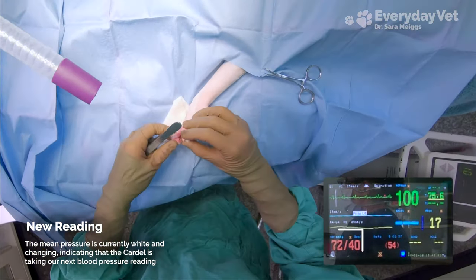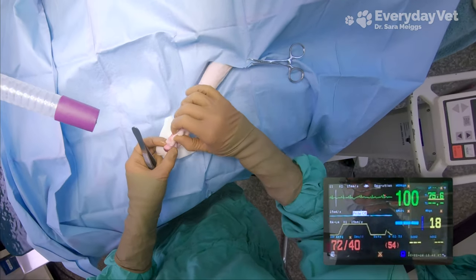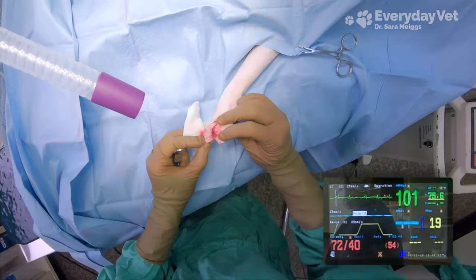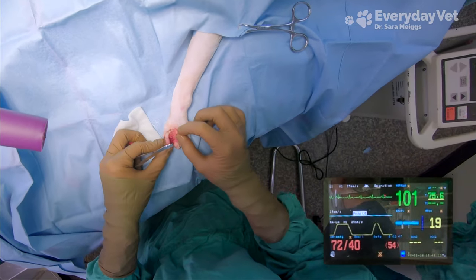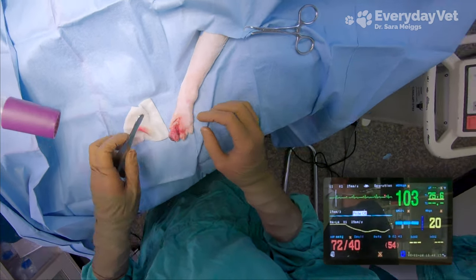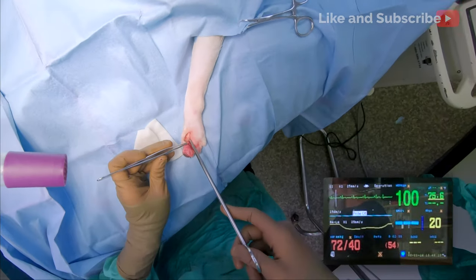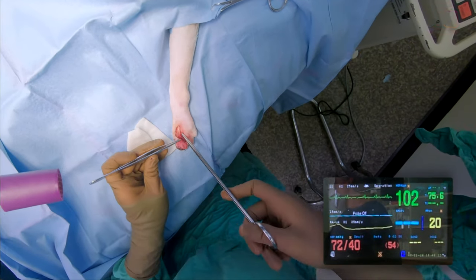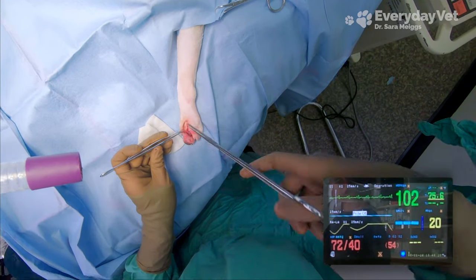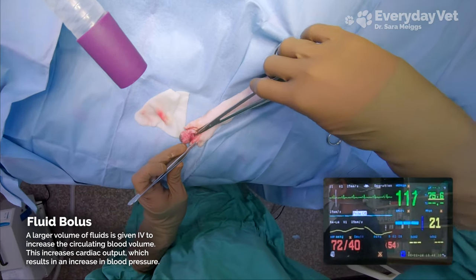We just got a new reading and the blood pressure is still too low. I have a long way to go before I get this toe amputated, so I'm going to have to try something else. If I leave it untreated, prolonged hypotension can actually cause tissue damage from not enough oxygen and blood reaching the tissues. It doesn't matter if I get the toe removed if the patient can't recover from the surgery, so I need to address it. I'm going to increase the cardiac output by increasing the circulating blood volume, so my assistant is going to be giving him a fluid bolus — a larger volume of IV fluids administered over a shorter period of time.